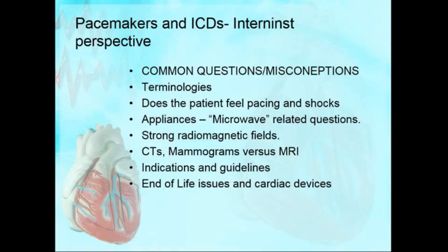So if somebody had a device before which is not MRI compatible, that means it's no longer MRI compatible, just for teaching purposes. Again, if there is a resident who does not know that there are MRI compatible devices, today you know. There are MRI compatible pacemakers and defibrillators. And you could also argue, why do they not make all the devices MRI compatible? I think eventually that will be the case.